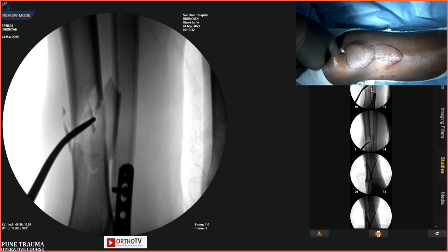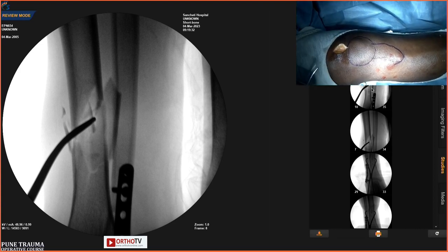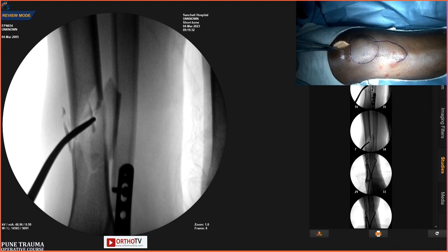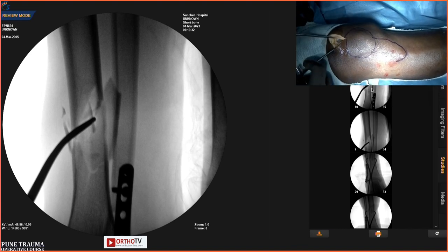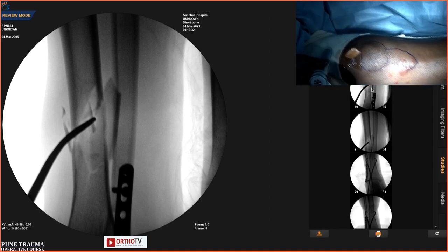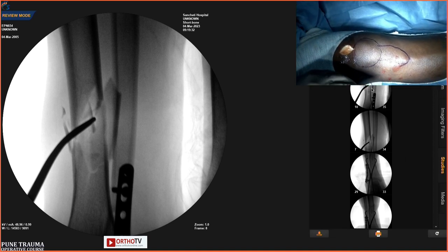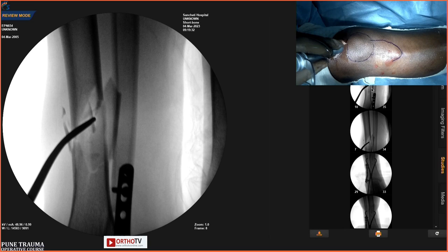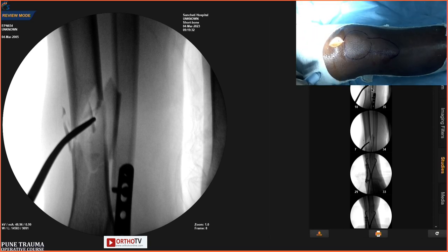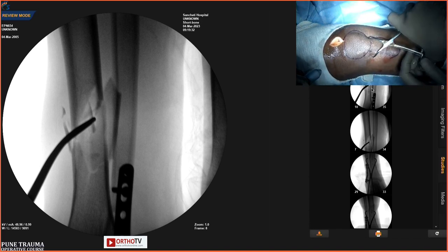This is the most important step. You can put a finger or you can also put an artery forceps. You can do whatever you like. But using the finger is our Indian way, so using the finger is better. So you can see here, now he will pass a sleeve. So before passing a sleeve, one precaution, put a towel clip. It is very difficult for us.